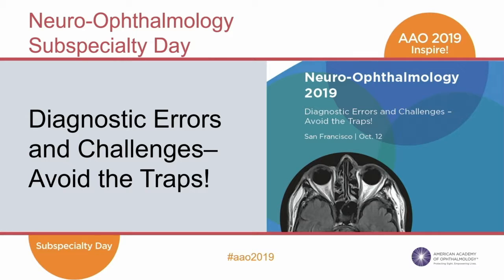So you could have poor signal strength. The patients with myopia have thin retinas. You get low values routinely. So you really have to first look at the quality of the scan and make sure that you're not getting falsely low numbers that would misguide you.